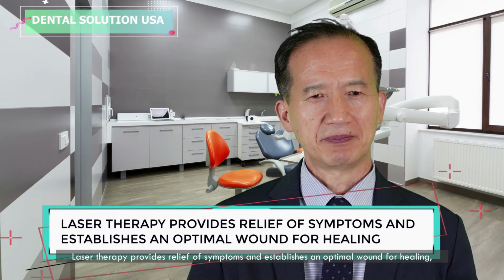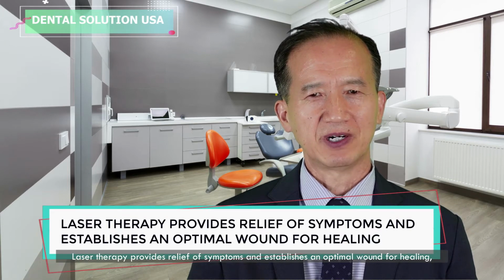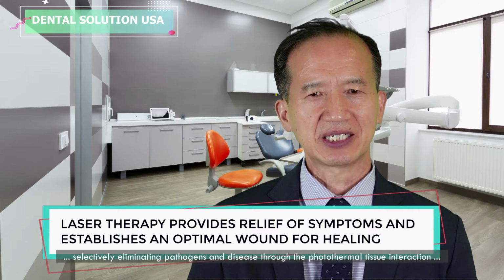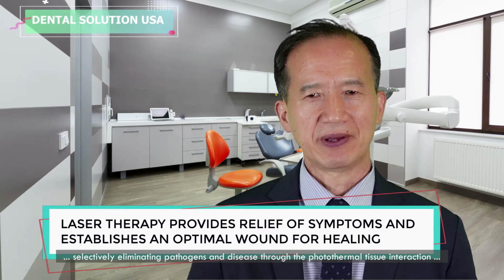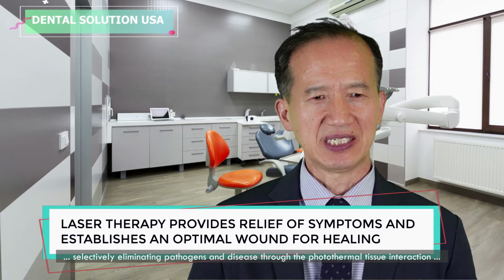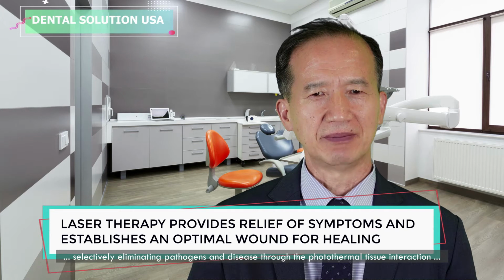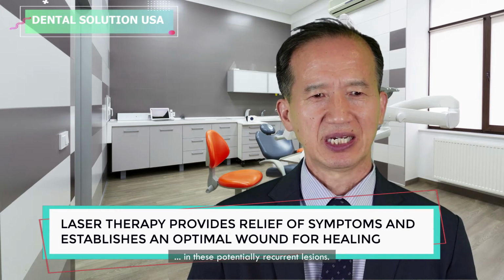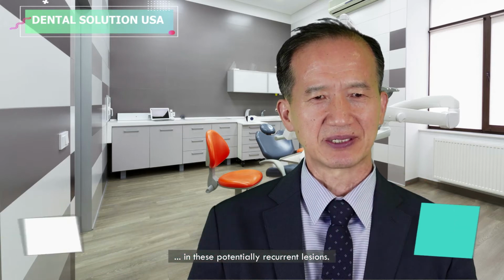Laser therapy provides relief of symptoms and establishes an optimal wound for healing, selectively eliminating pathogens and disease through the photothermal tissue interaction in these potentially recurrent lesions.